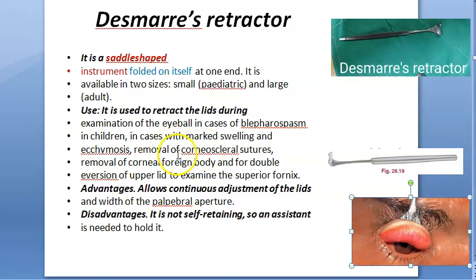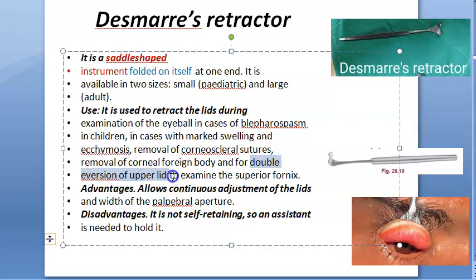Mainly, the key use is double eversion of the eyelid to examine the superior fornix. How will you examine the superior fornix? It's very difficult — you have to double evert the eye, and you have to use Desmar's retractor for this. It allows for continuous adjustment of the width of the palpebral aperture, so you can control how much you want to see.